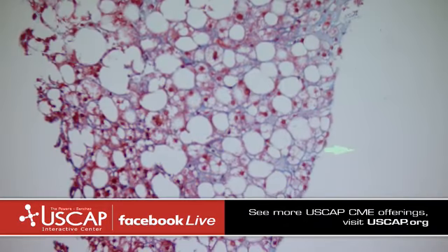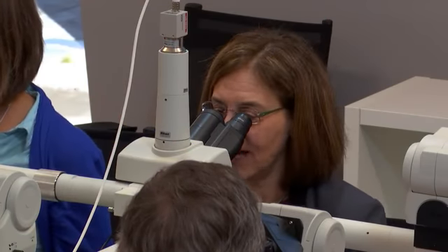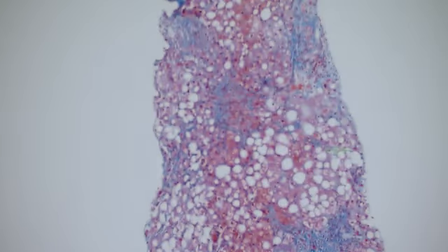And do you need this for a diagnosis of steatohepatitis? No. So that's important. It helps me. You need the inflammation, the damage, and the fat. You don't need this. You typically do see it, though, in cases that have steatohepatitis. And again, I look in the areas with the most ballooning, and that's where it's really most prominent.